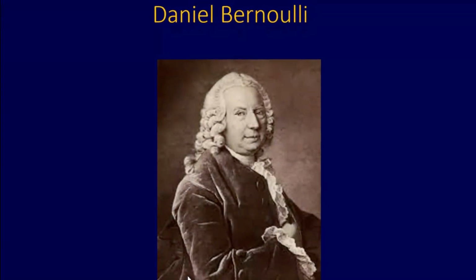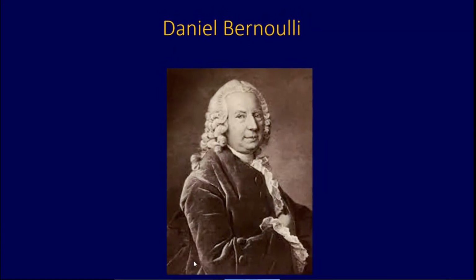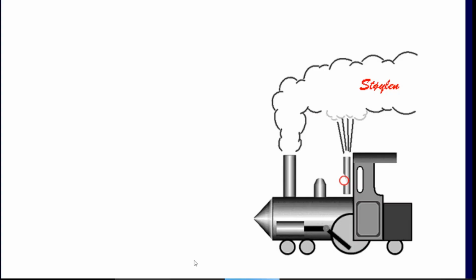The second name is Bernoulli, who is from Switzerland, in the place called Basel. He's a mathematician and he was involved in fluid mechanics, and he discovered that the pressure gradient across the constriction is equal to four times the velocity squared.